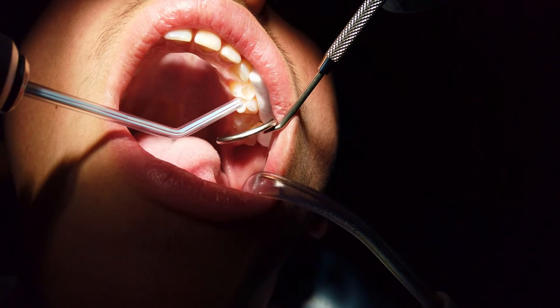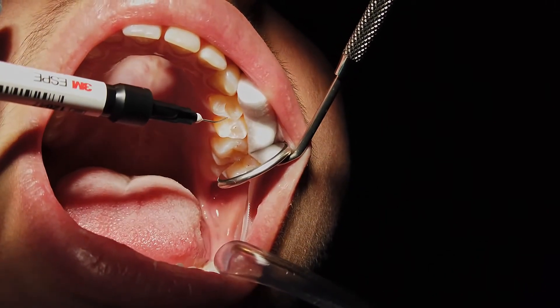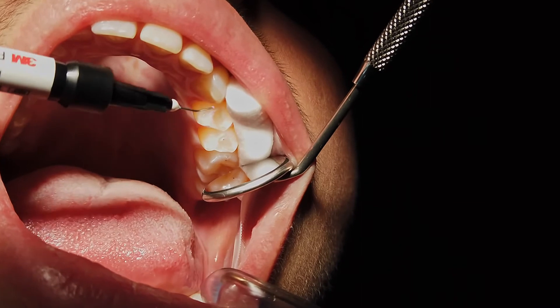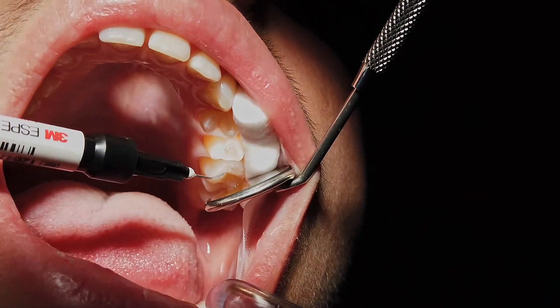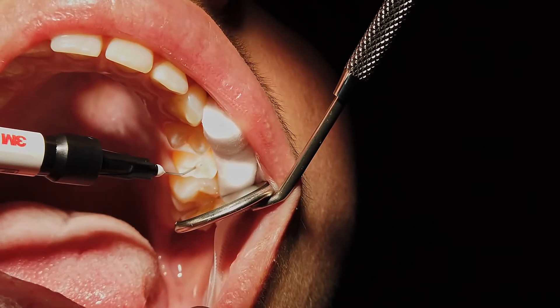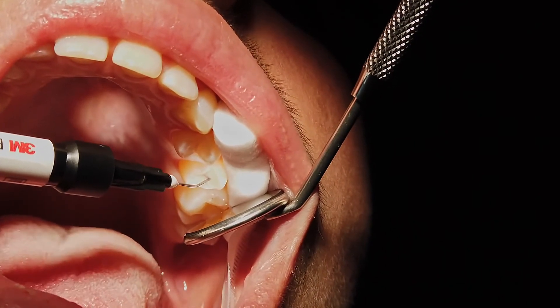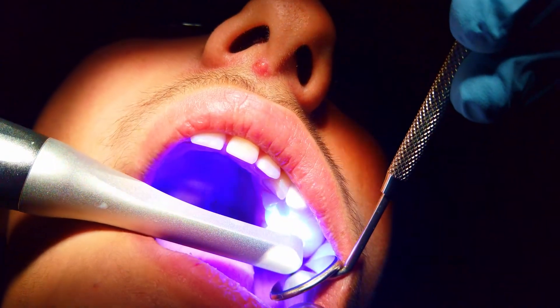After washing the solution and drying the tooth, the sealant is placed on the grooves in a fluid-like form. The sealant is then activated with a blue light, as demonstrated.